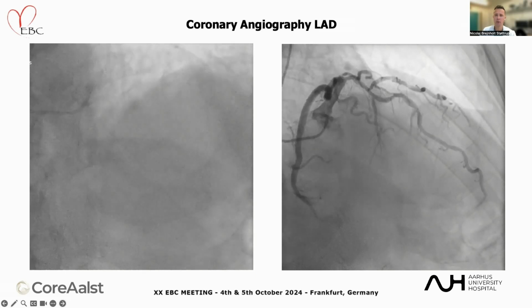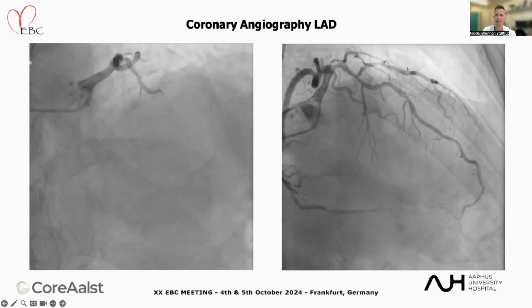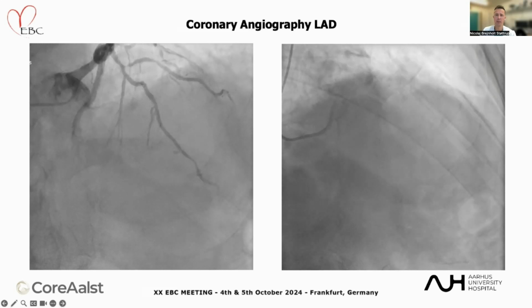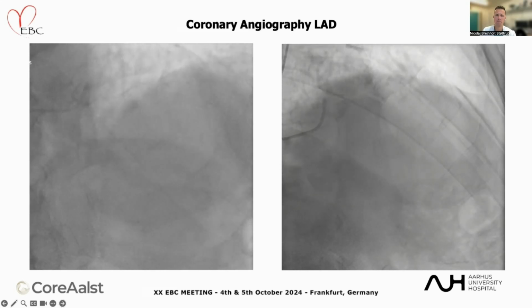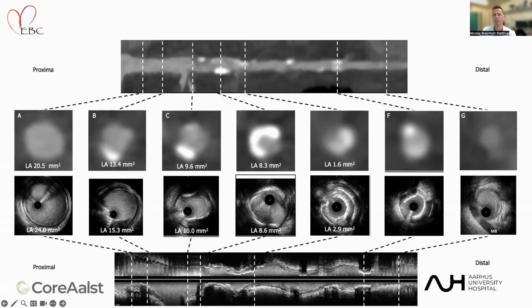And this is the angiogram showing the LAD in orthogonal views, confirming angulated anatomy and severe ostial disease, involving in particular the LAD D1 bifurcation. Pressure wire physiology testing confirmed significant disease in the LAD at 0.75. Confirmatory IVUS aligned with the CT demonstrating circumferential calcium in the LAD just exceeding an arc of 180 degrees and fibrocalcific disease in the proximal LAD.